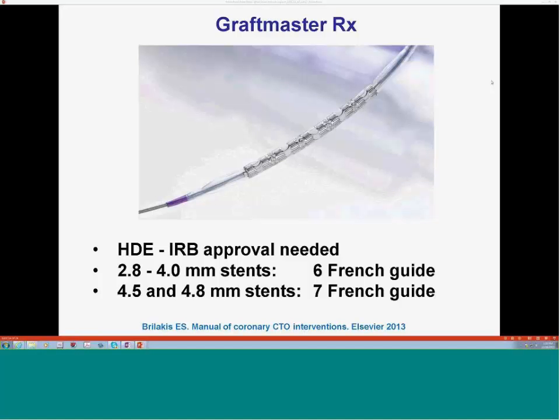And so, because this is not approved for clinical use, it's supposed to be a research stent. Yeah, for both though. This one and the old one, both of them are research stents. Yeah, but you need to get a new application to get the new product. That's what I was told.